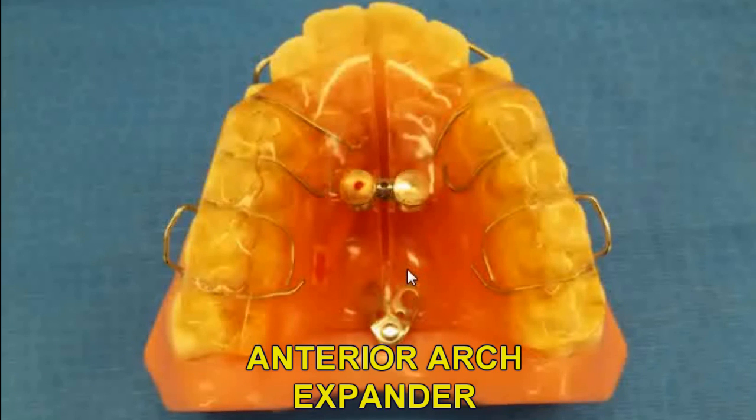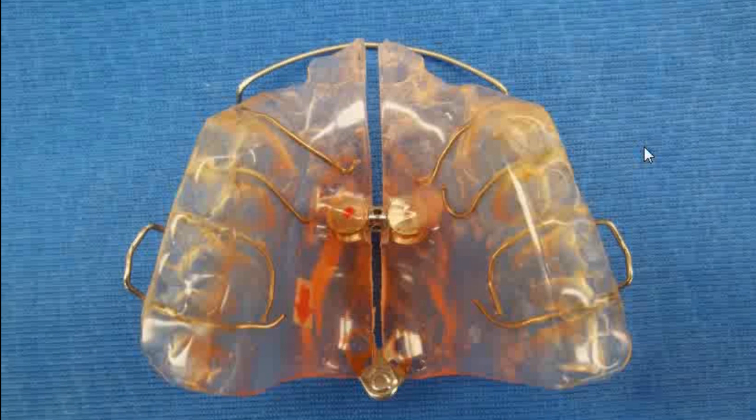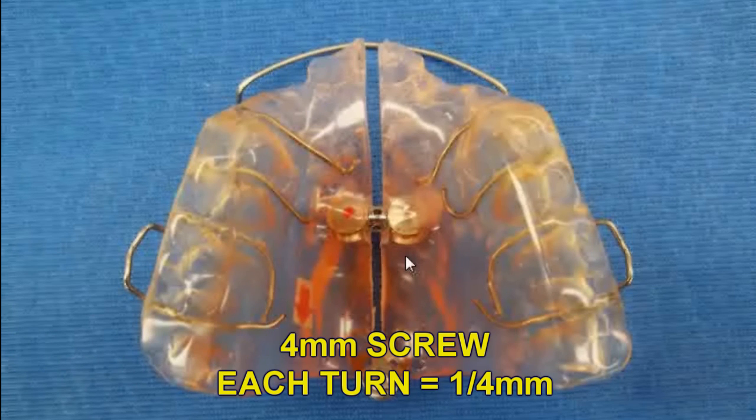This appliance can be used in the mixed or permanent dentition and is effective for adults. The components of this appliance are the same as the Schwartz appliance except for the different type of screw. You can add lap or finger springs to this appliance to align the anteriors in the same way. The anterior screw in the fan expansion appliance is smaller than the standard screw. It's only 4 millimeters. Each turn is still a 1/4 millimeter.